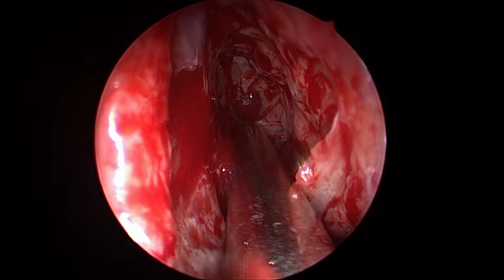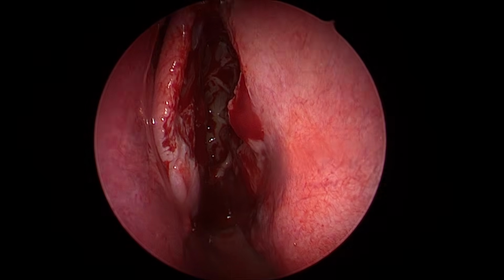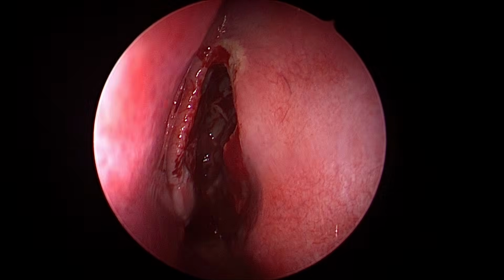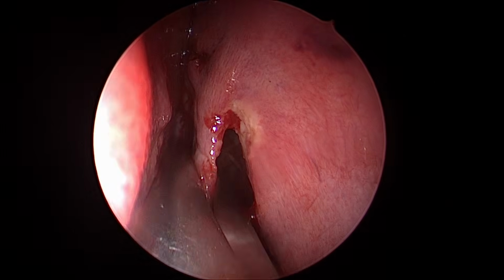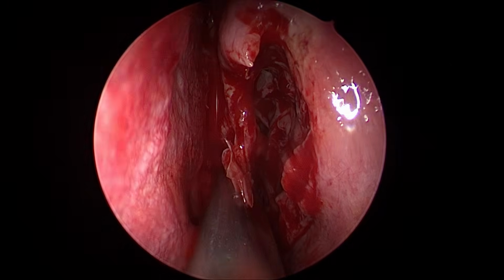See this? Even the uncinate process is not adequately removed. Whenever you operate, if your surgical work is not adequate, you are unlikely to get the result. Once you operate, you have to give a good access. See what I am doing? Partial trimming. This is floppy. And see what I am giving now?